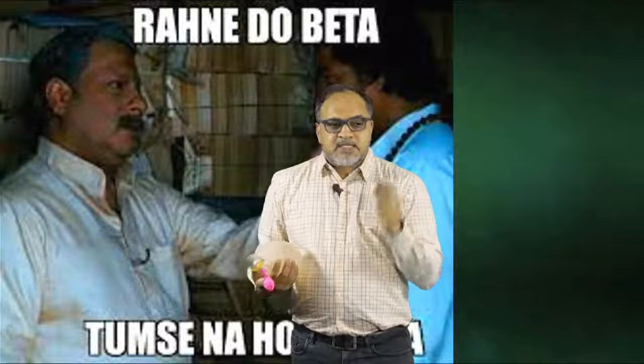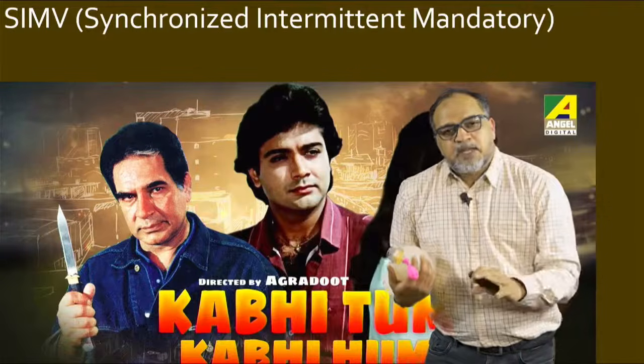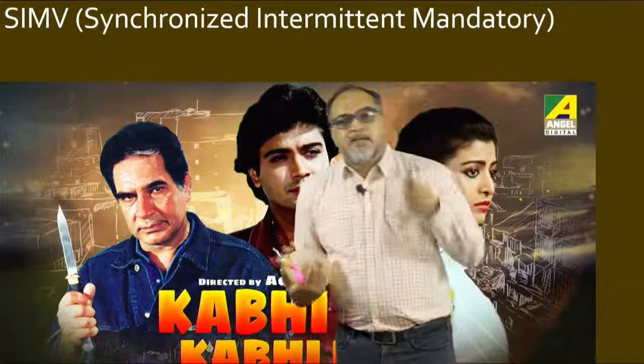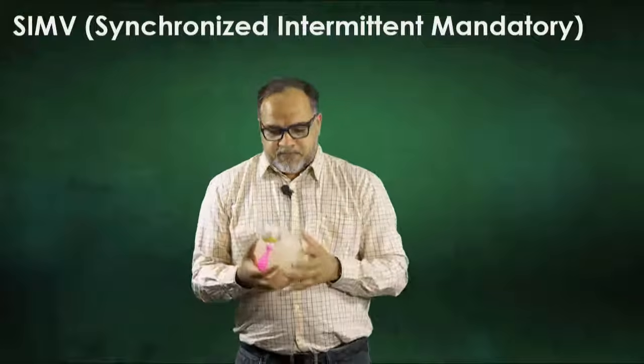Then came the mode called SIMV. In SIMV, the patient will also breathe and the ventilator will also give its breaths. That was called synchronized intermittent mandatory ventilation. Now, what does it mean? Let's say we have set a rate of 10 breaths per minute. That means in 60 seconds, 10 breaths have to be delivered. Every 6th second, 1 breath will be delivered.